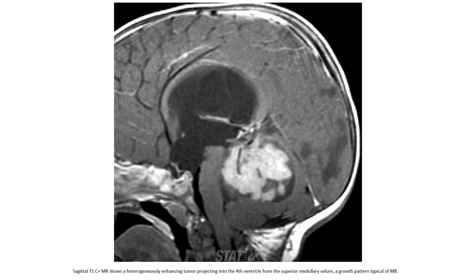T1 contrast-enhanced MRI shows a heterogeneously enhancing tumor projecting into the fourth ventricle from the superior medullary velum, a classic imaging appearance of medulloblastoma.